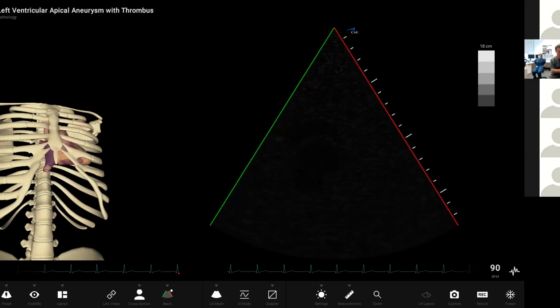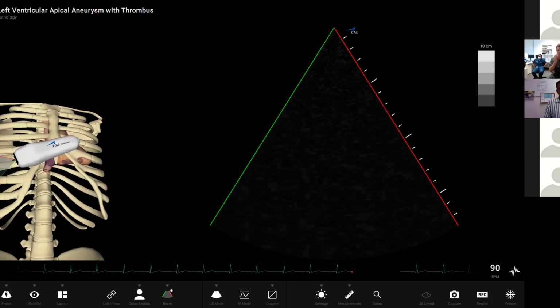Great, so that's about it. That's about all I've got to say about all the little tips and tricks for imaging difficult to image patients. To summarize: make sure you've got the patient optimized, your position optimized, your machine in a comfortable position, the lights down. In each view, try a standard view, but then go off-piste if you can't get the view you want.